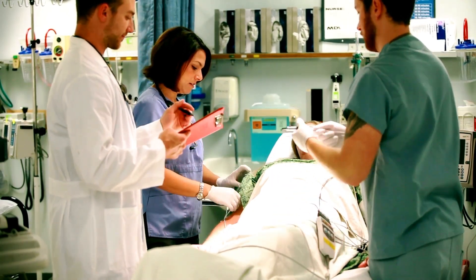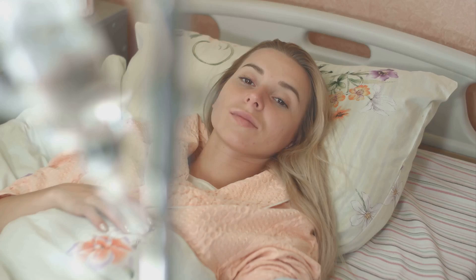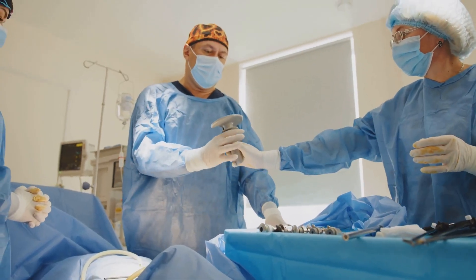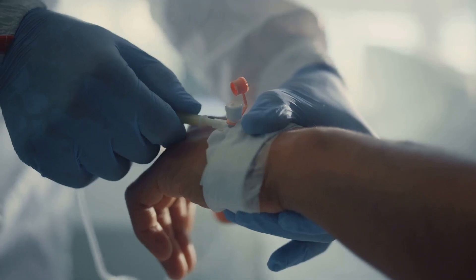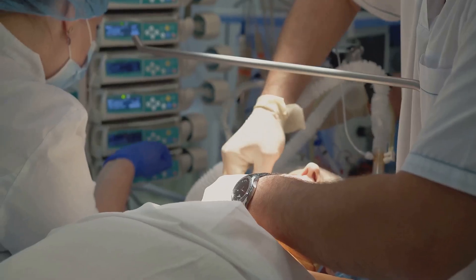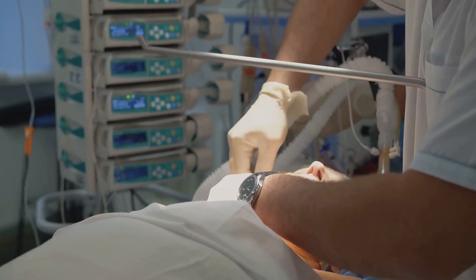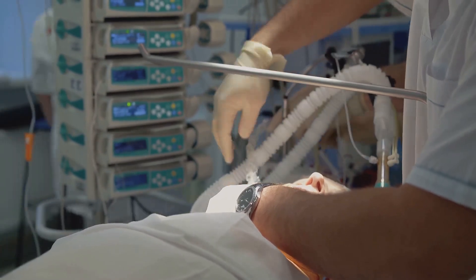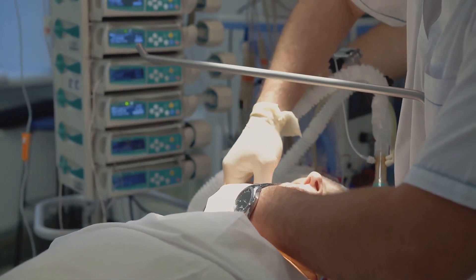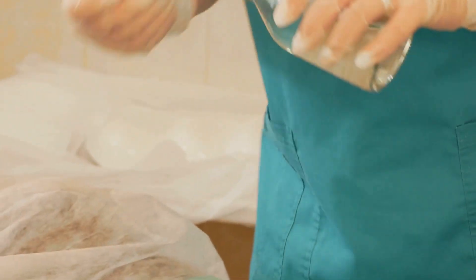Imagine this. A patient needs emergency surgery. They might be scared, possibly in pain. The surgical team needs to act fast. This is where IV access becomes a literal lifeline. IV cannulation allows us to deliver anesthesia swiftly and safely, ensuring the patient is completely unaware during the procedure. But it's not just about anesthesia.